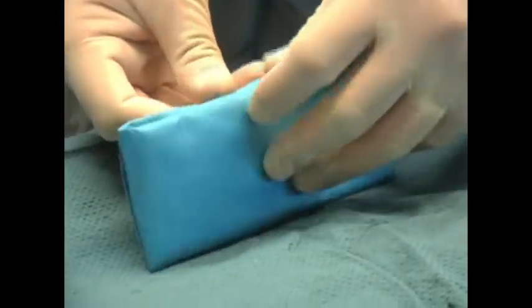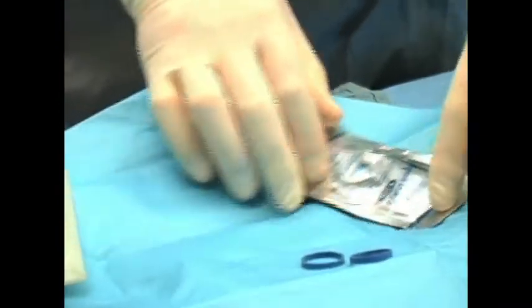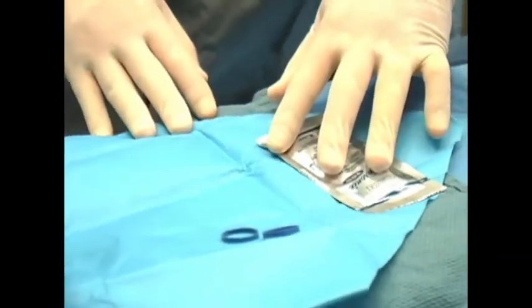The patient has been prepped and draped in sterile fashion, and now we need to prepare the transducer. Dan is opening a sterile kit that contains a sterile sheath, which will be applied over the transducer, gel that's also sterile that will apply on the outside of the sleeve, and 2 rubber bands for securing the sleeve on the transducer.